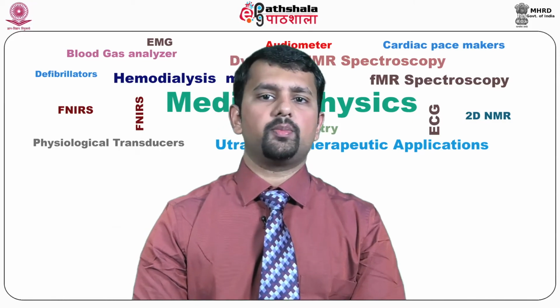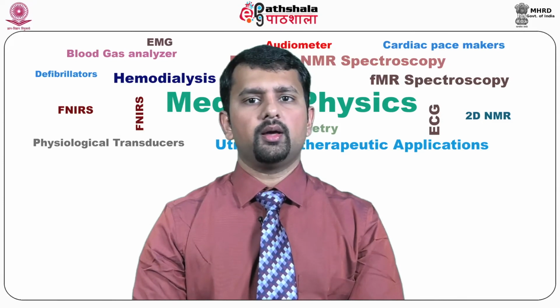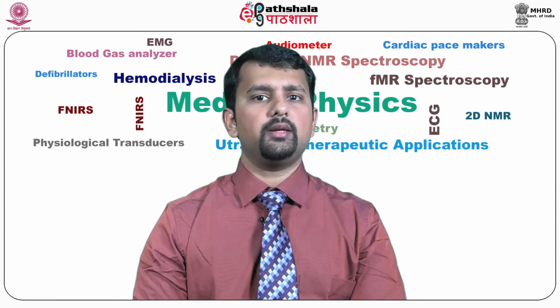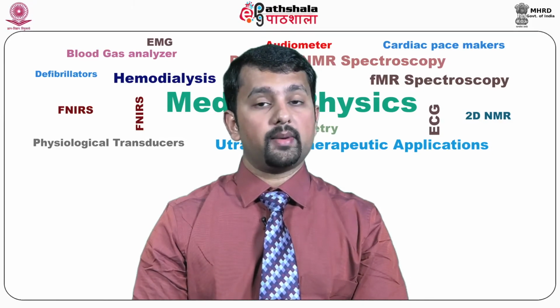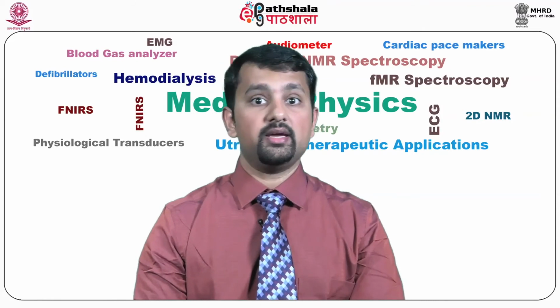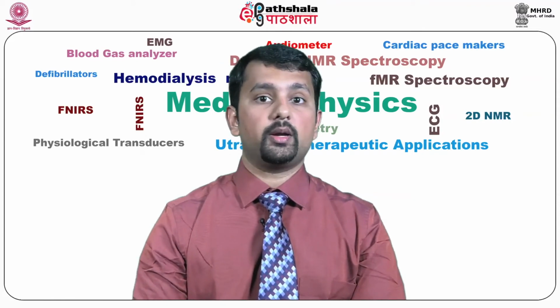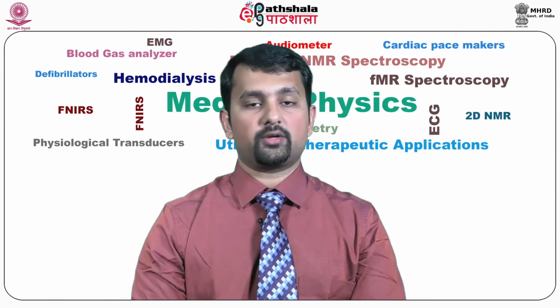Proton MR spectroscopy at 1.5 Tesla or 3 Tesla is difficult. The dominant signal of choline containing compounds at proton MR spectroscopy is attributed to glycero-3 phosphocholine rather than the phosphodiesters or phosphomonoesters as in phosphorus MR spectroscopy.